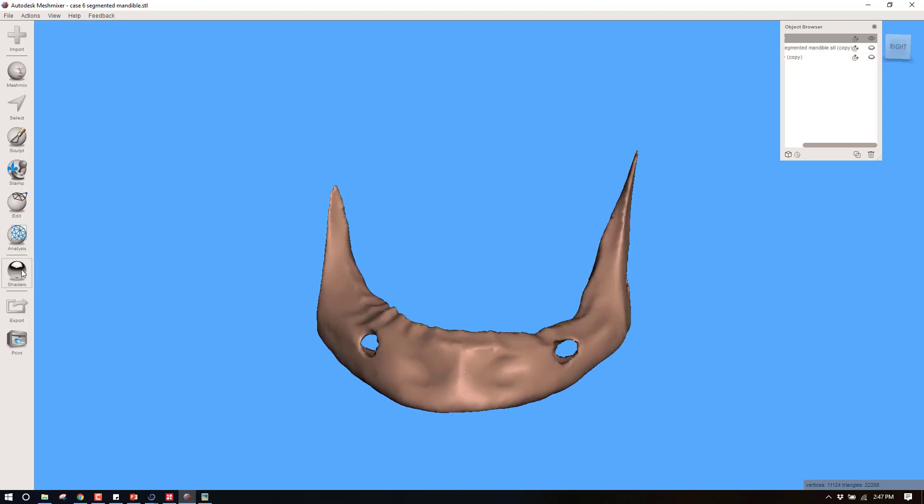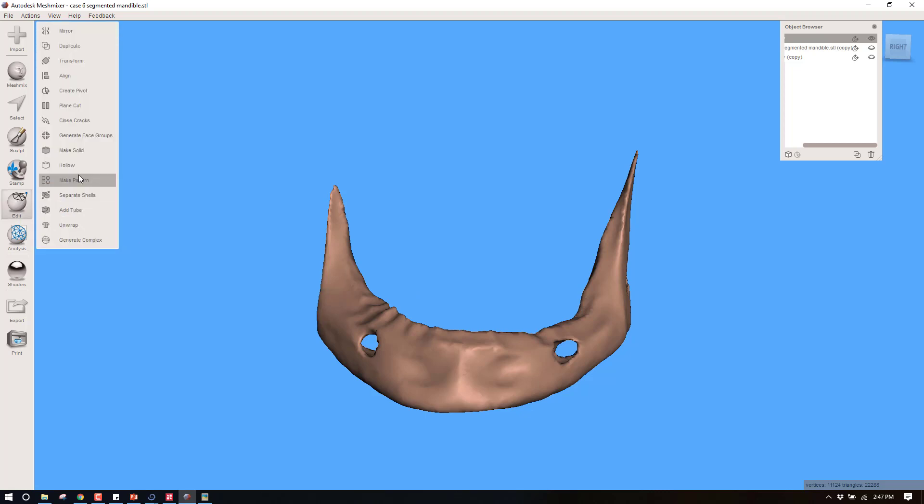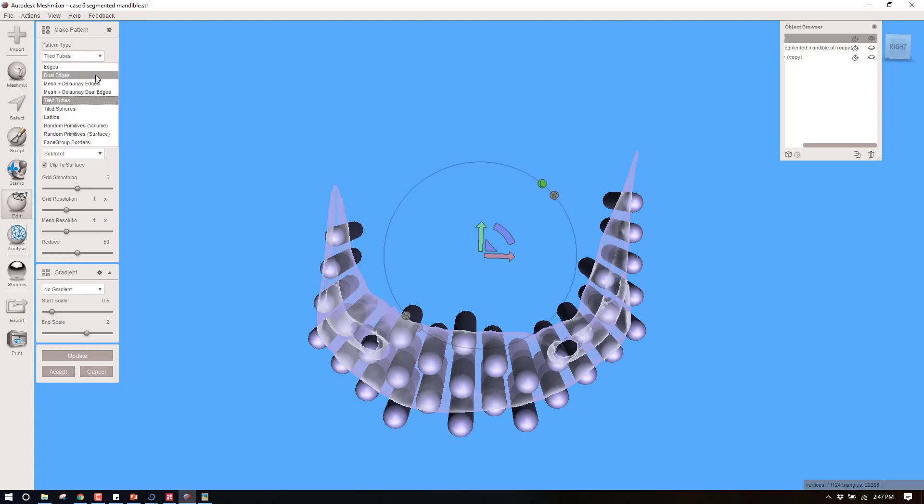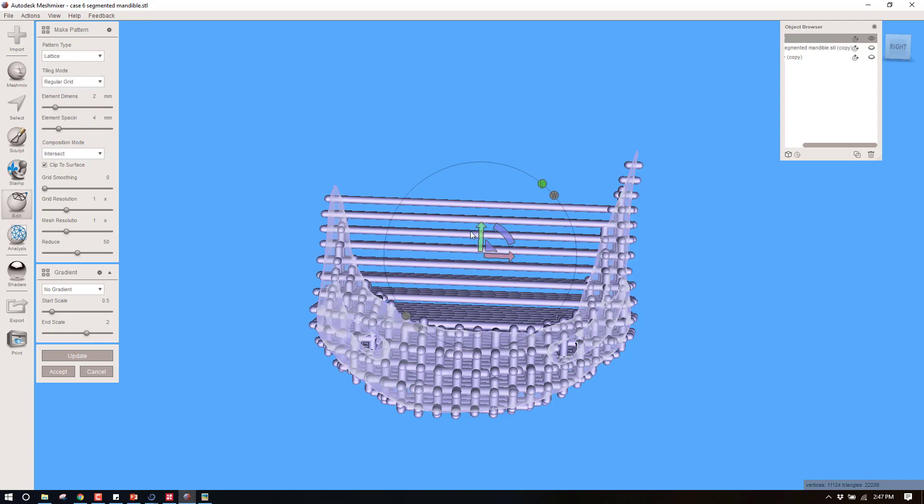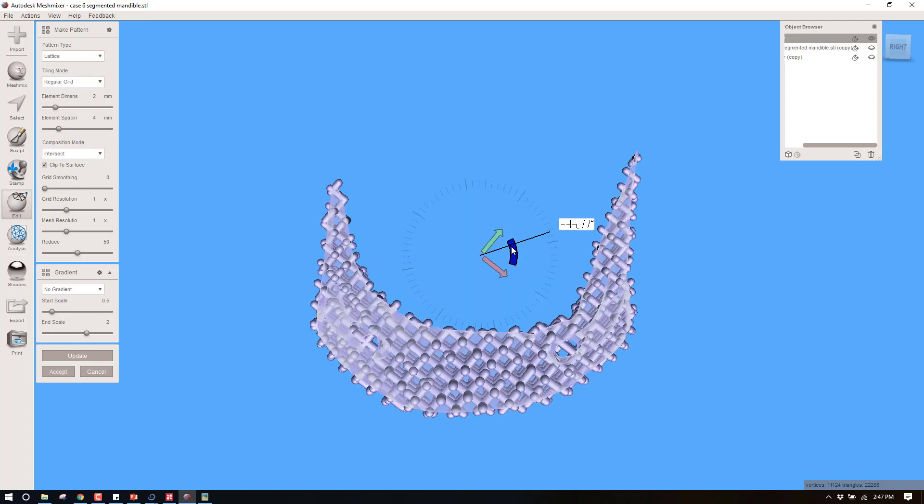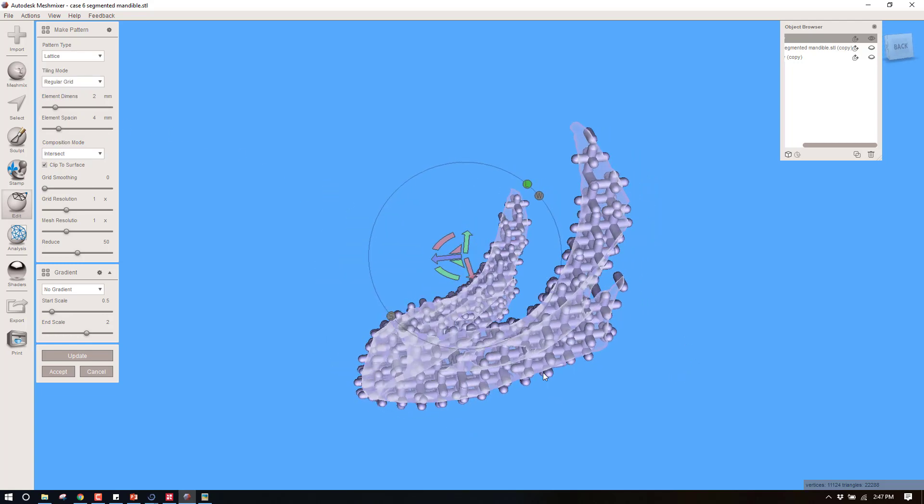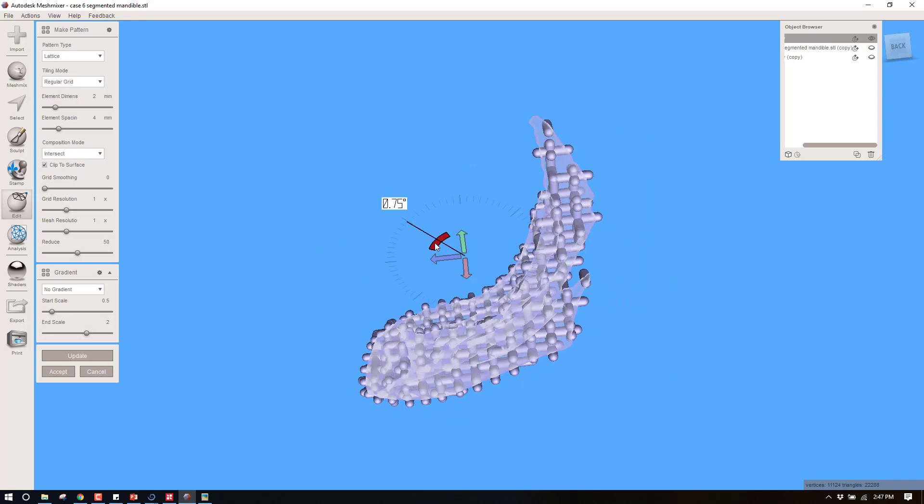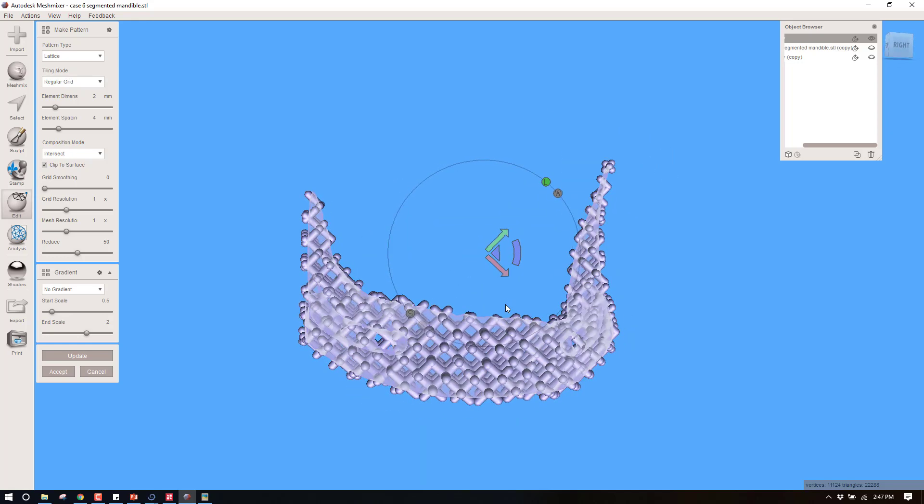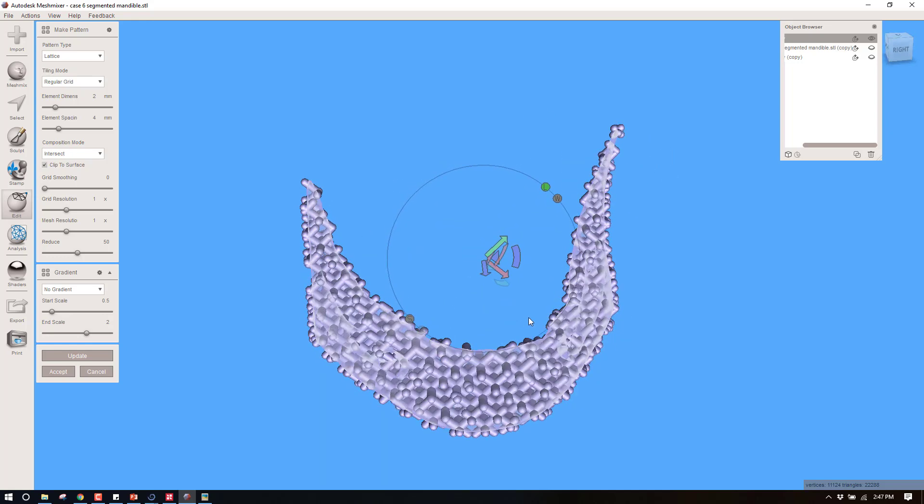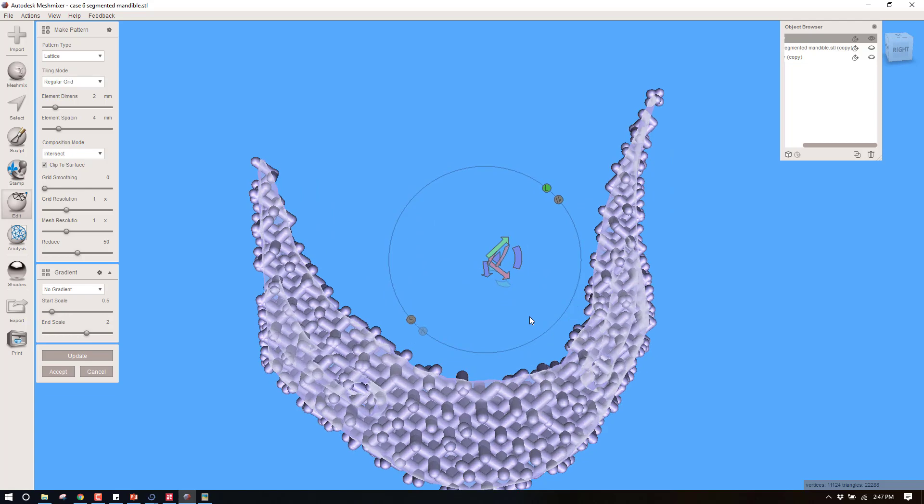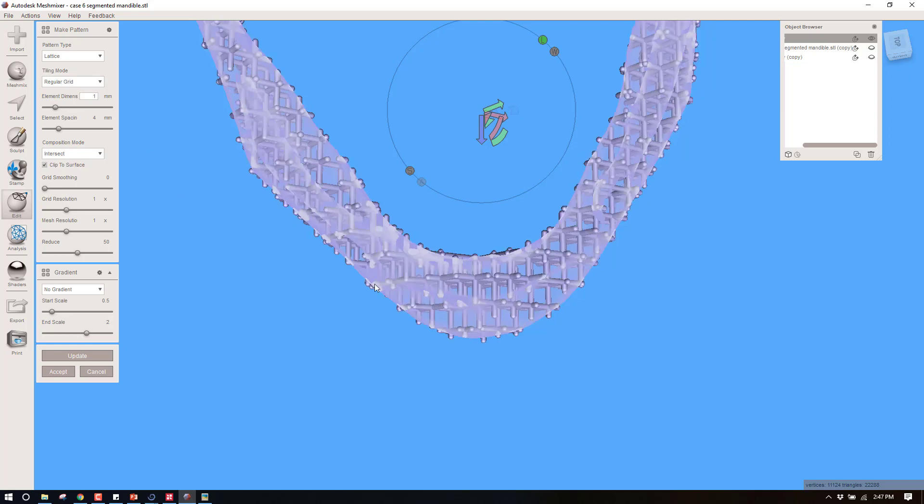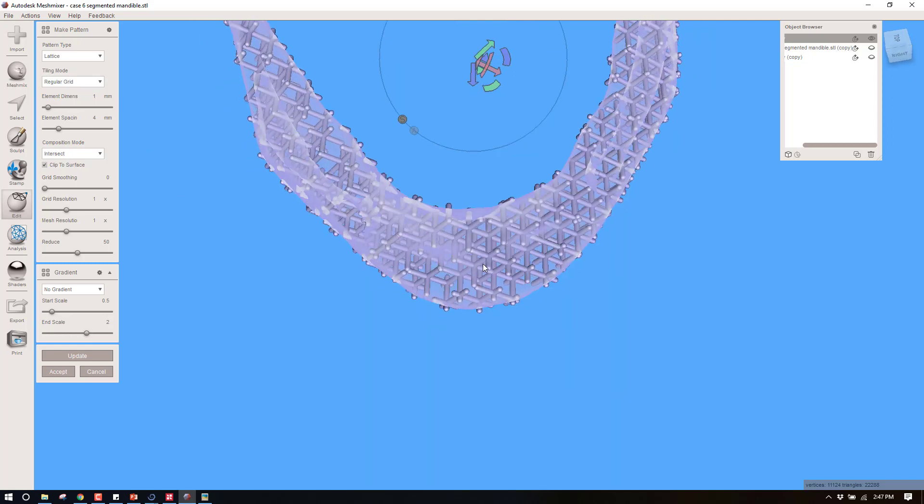With this now come over to Edit and Make Pattern. Meshmixer gives you the option of creating some cool little patterns. I like the lattice, and you can orient this lattice into whatever manner you want. You can spin this around, change the angles. You can also define the dimension of these little members. So what kind of bone do you want? Do you want this to be relatively dense? Then you might go up here and for your element dimension I typically find about one millimeter is ideal.